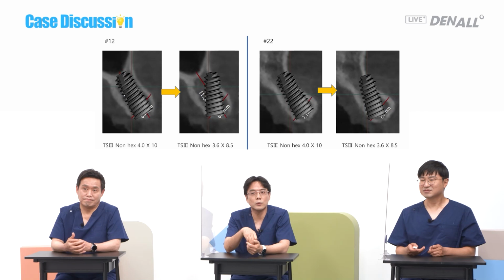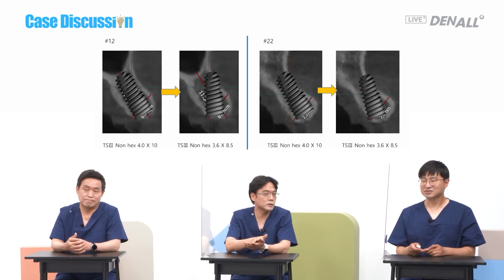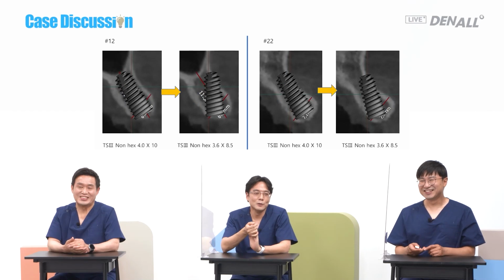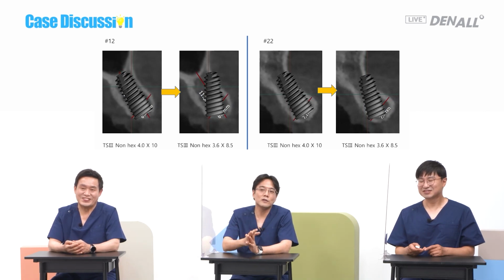Decortication would be difficult because the implant would be interfering. If the cortical bone is thick, decortication is difficult. The bone graft can be successful, but there is a possibility that it can go wrong, so I will choose the left and I'll ask the prosthodontist to do the rest of the work, apologizing that the whole direction is not very good. And I'll ask the prosthodontist to use a cement or lateral screw, whatever. The supramargin looked pretty good.